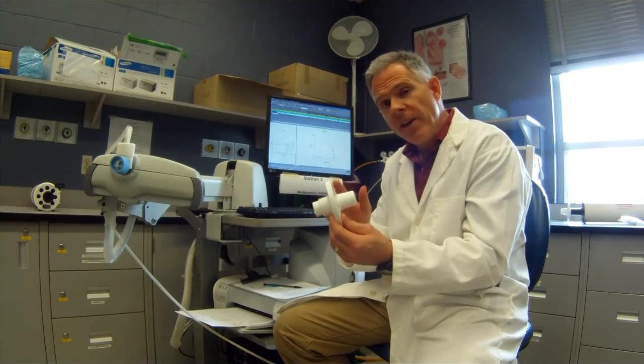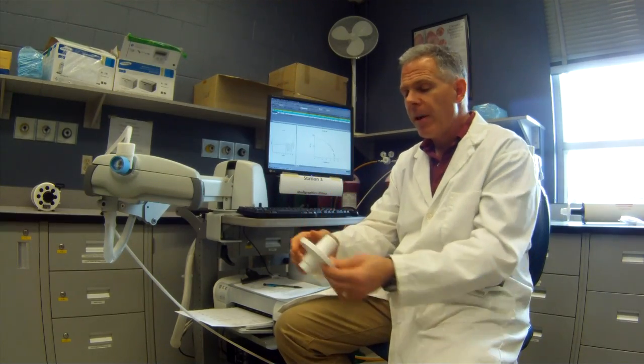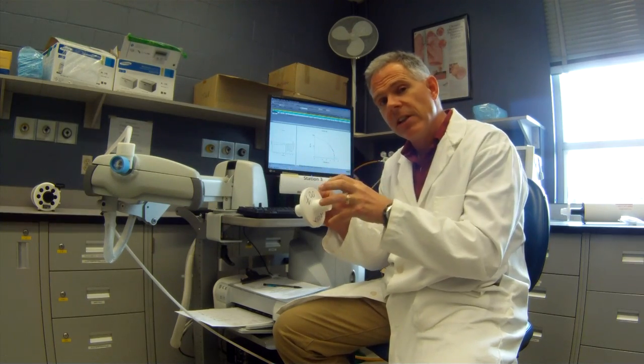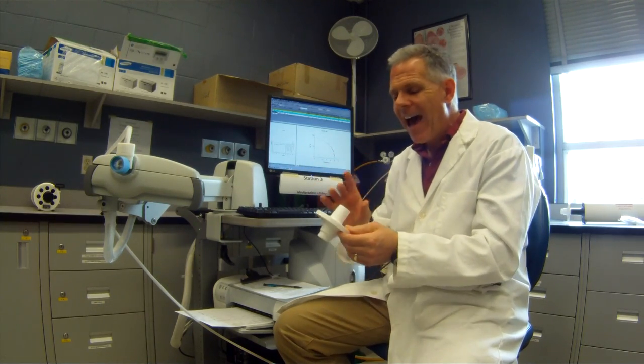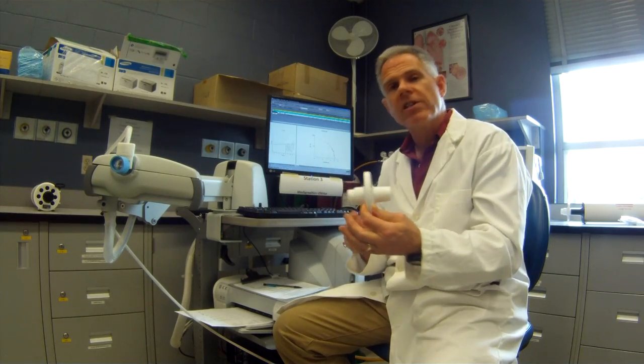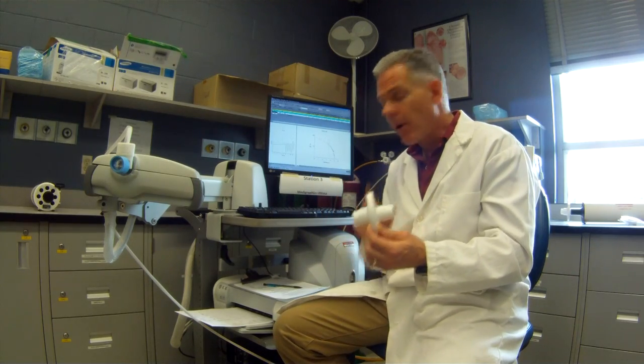Okay, well, like always, we're going to have a good background history on the patient. We're going to use our filter. They've got to put their teeth on the outside, get a good seal. And with this particular test, having a good seal is really important because they're going to be breathing through this for probably anywhere from 6 to 7 or 8 minutes. All right, so that's important.